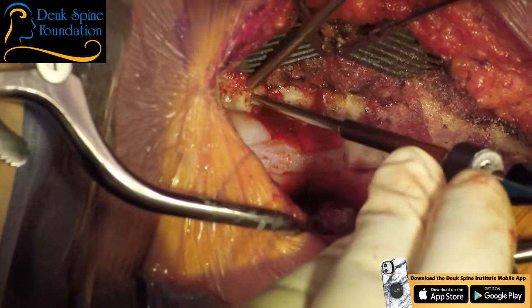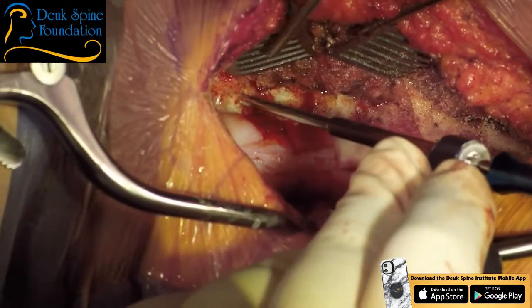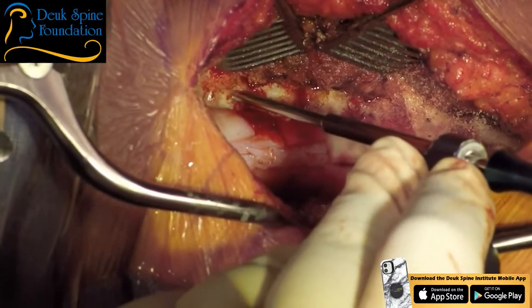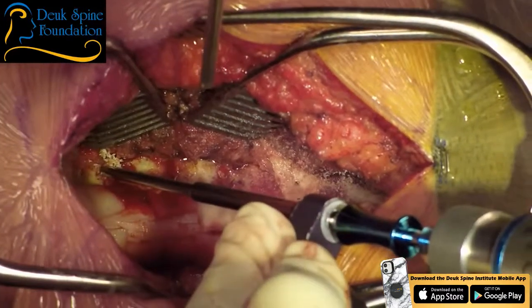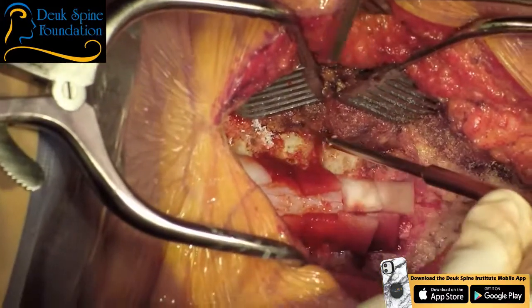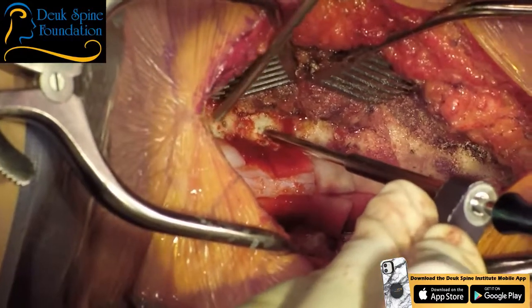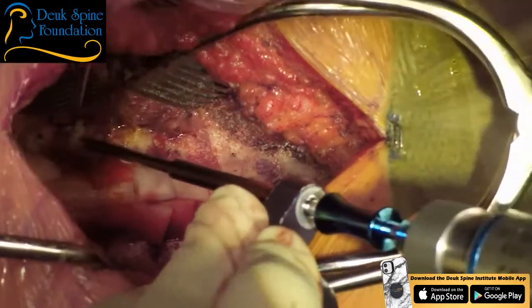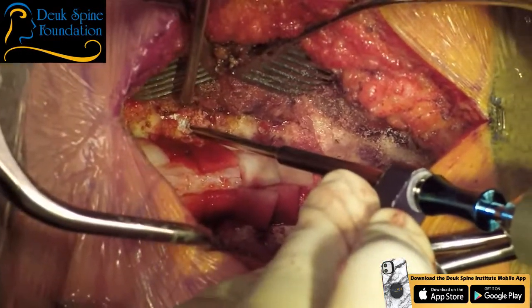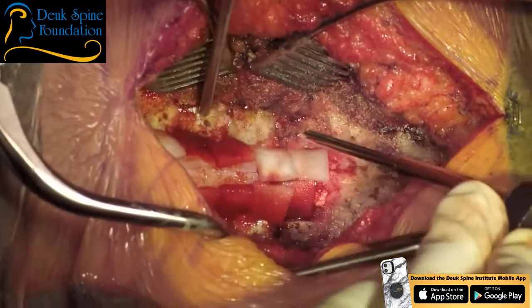Here's C4. I like to go segmental. I feel the more points of fixation, the better. There's some rotation here. I can see it. And the other thing I like to do is kind of let the drill bit guide itself. Now I'm using a 14 millimeter bit. It's very important. You don't go longer than 14. Three, four, five.